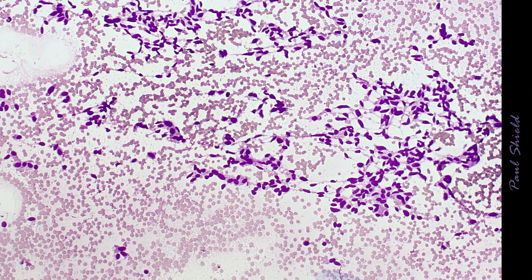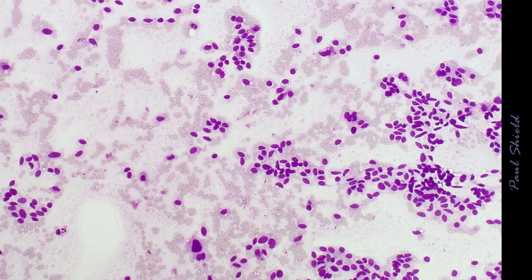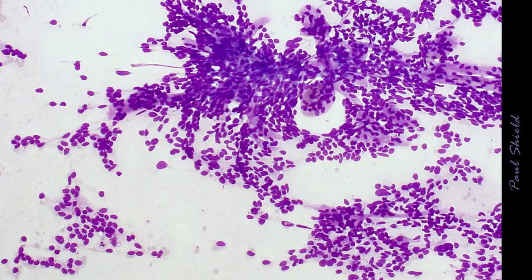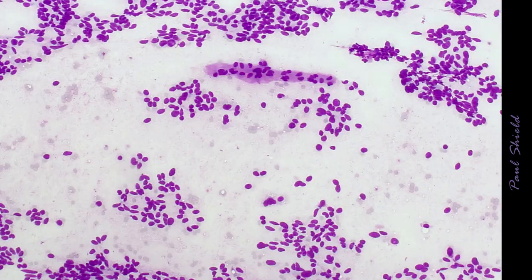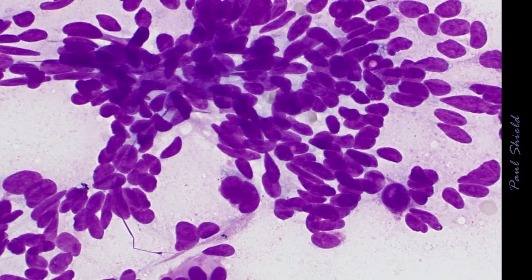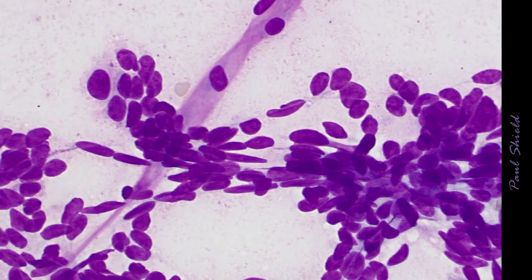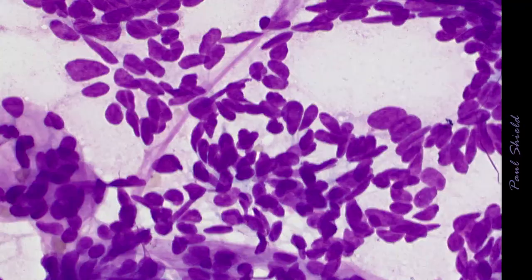This is another example and another pattern that's seen. That first pattern, the plasmacytoid appearance, really is, in my experience, the most common, but you can get a real spindled pattern, which is what this is. You can see that neuroendocrine pattern of a combination of round and quite elongate spindle nuclei. It's mainly dispersed, although they're in loose aggregates as well, and there is definite cytoplasm associated with quite a lot of these cells.